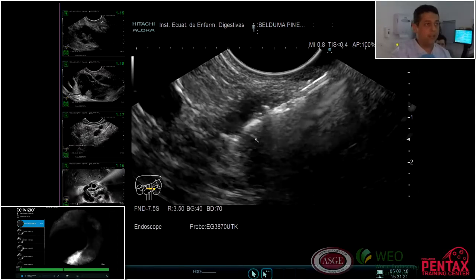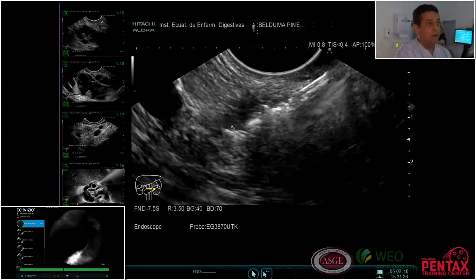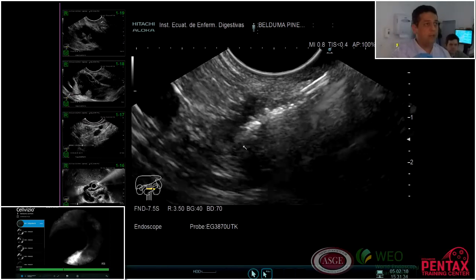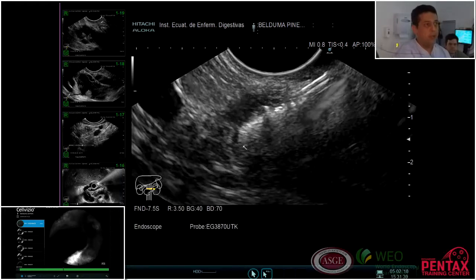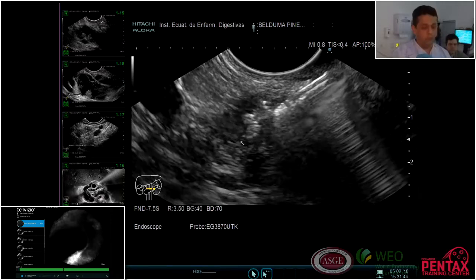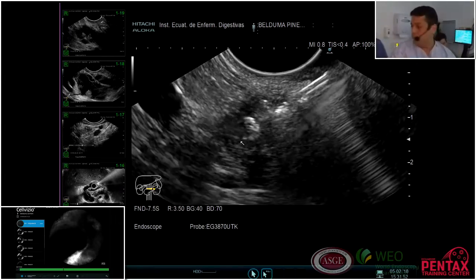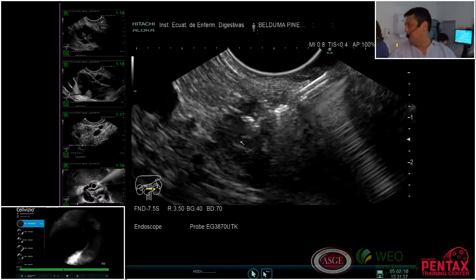So now we are inside again. You can see here the opening of the Murray biopsy forceps. This is a very good biopsy forceps. Cierra. Cierra. Now we have, you see here, the wall. So now we are very sure that we are taking a good tisular analysis, or at least we will have.